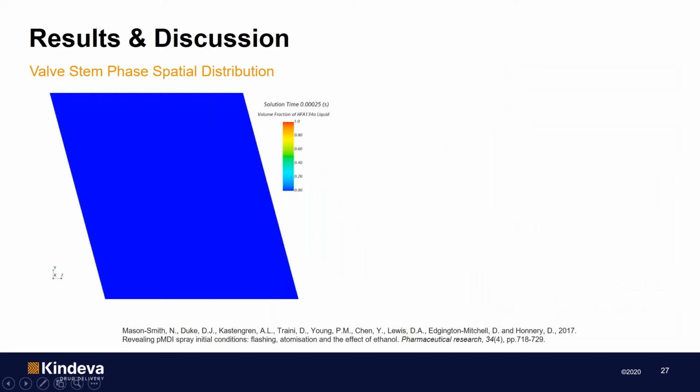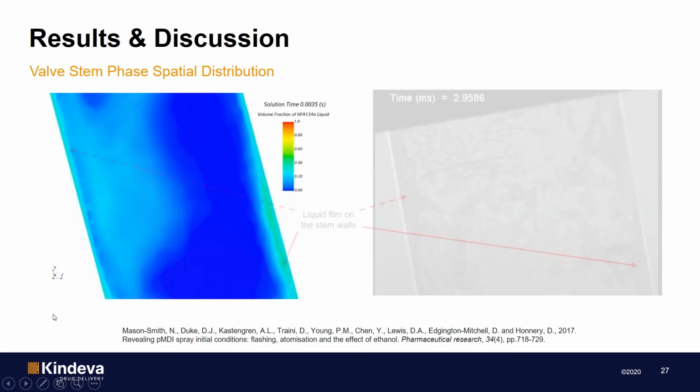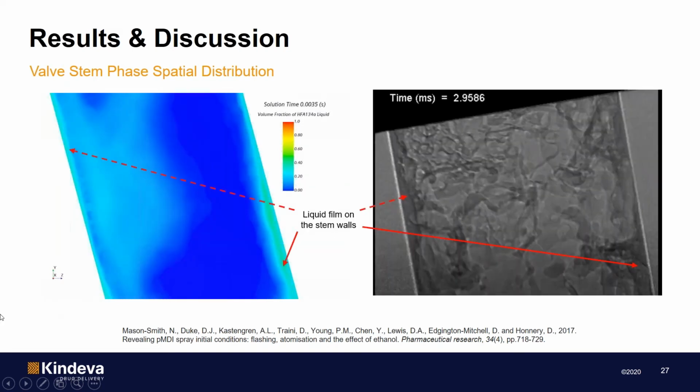So, next, we show a more detailed view of the mid-height in the valve stem, and to validate the trends of the model, we show a number of images that were taken from the literature. We note that the geometry of the actuator was not the same as in this model, but these results demonstrate that the trends of the model are hopefully credible. So the CFD model, right at the beginning of the actuation, predicts that the flow is characterized by liquid wall films and the vaporous core flow.